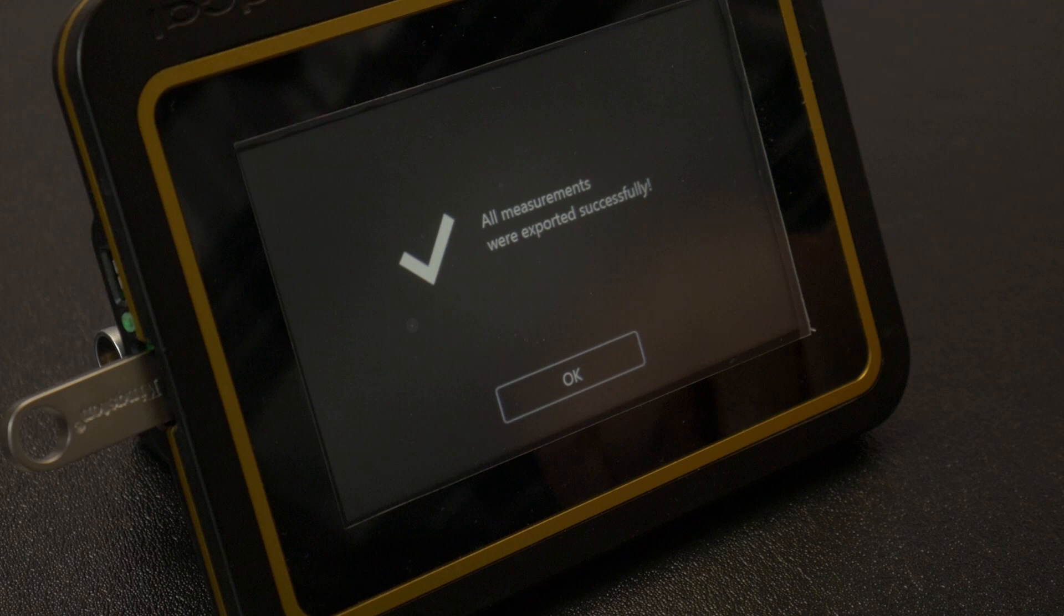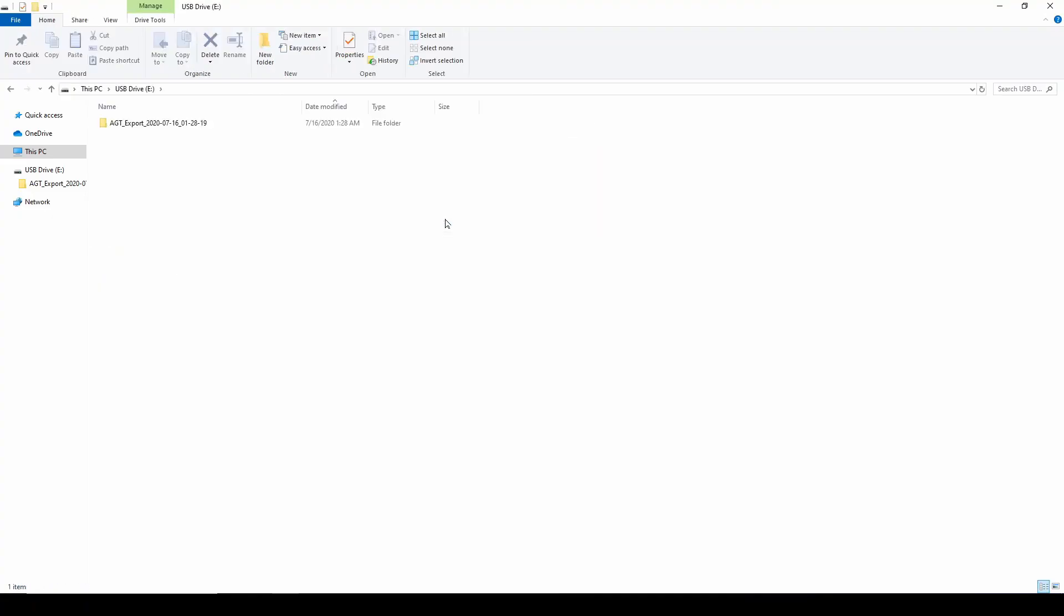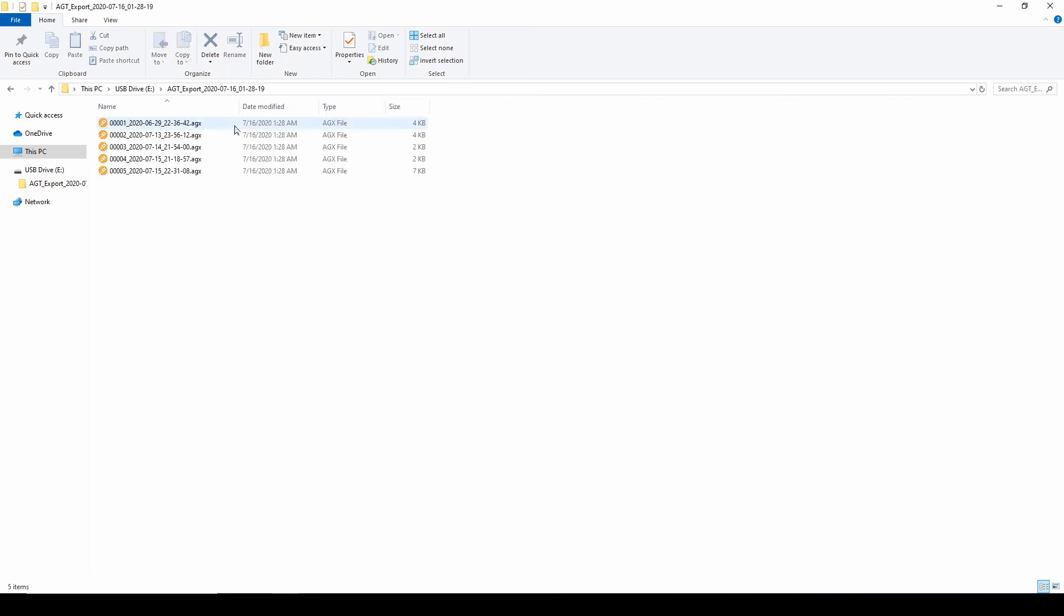Connect the flash drive to a Windows PC and navigate to the root directory. Open the AG export folder and select a session file to open.